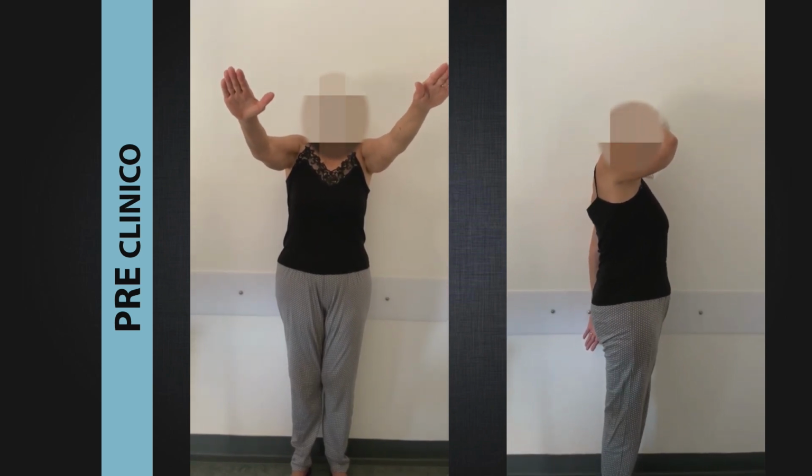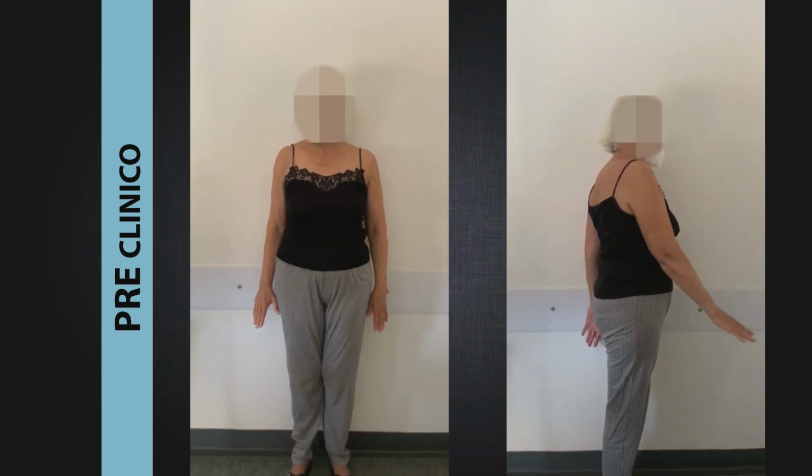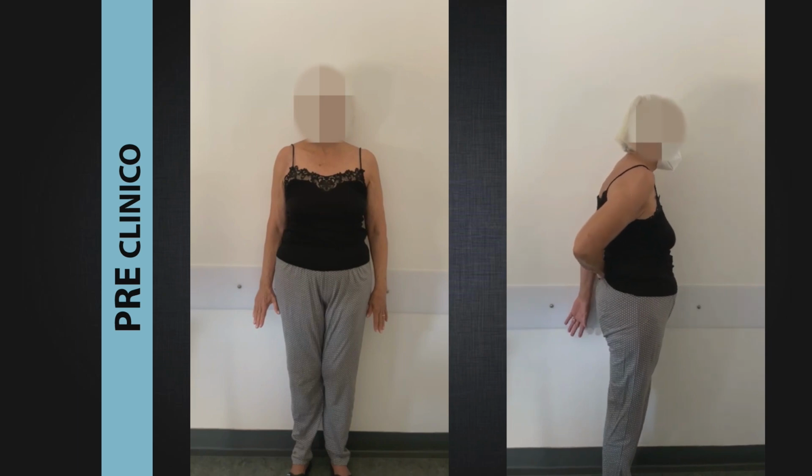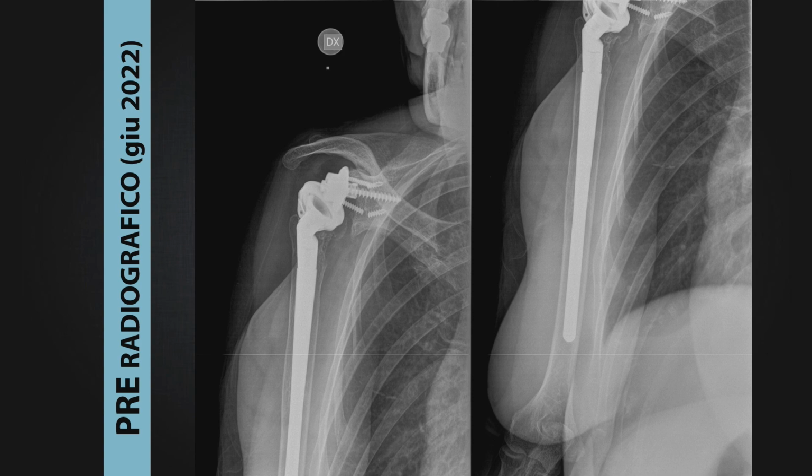It's the right shoulder. The movement is not so bad. She has discomfort. She's not happy. She's painful. So I asked for the X-ray. This is the X-ray. So my first question here is, is the range of motion good enough? She is painful, but she's not in a dramatic situation of pain. But this is the X-ray. Which is your position? Do you follow the clinical finding or do you follow the X-ray? Please, McBride.